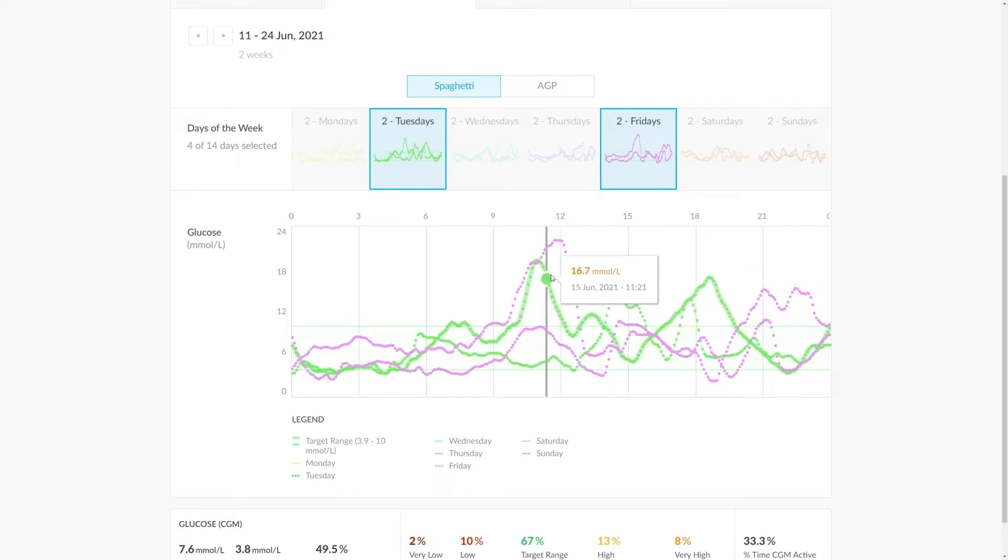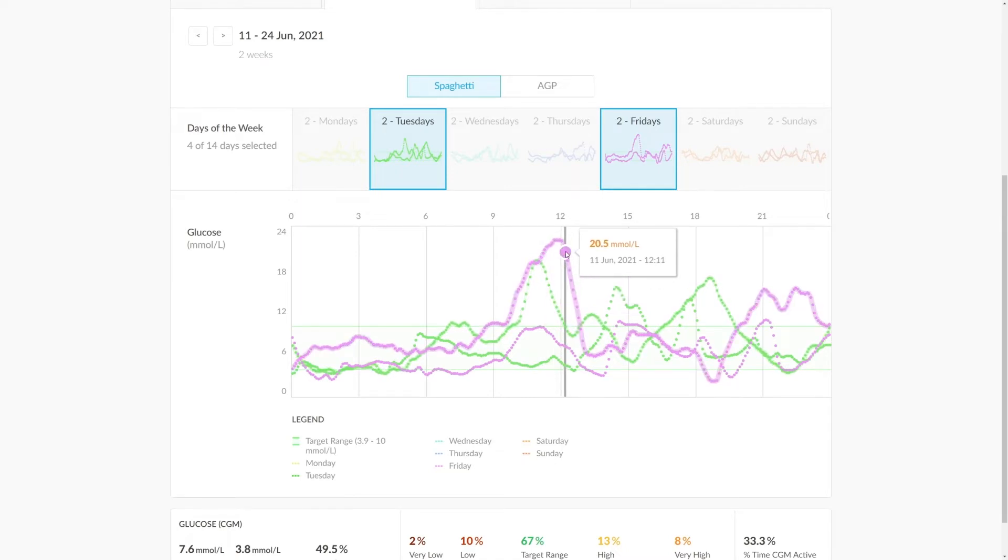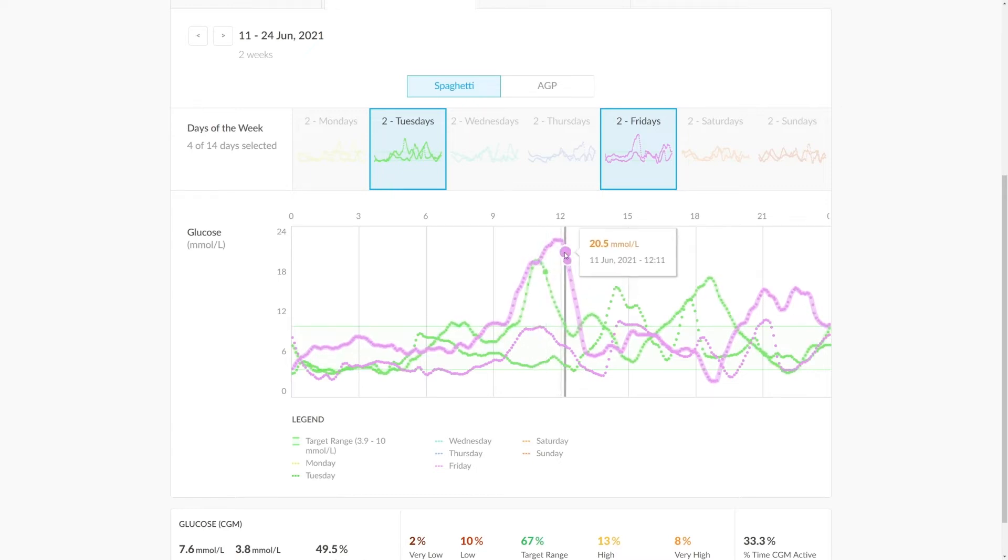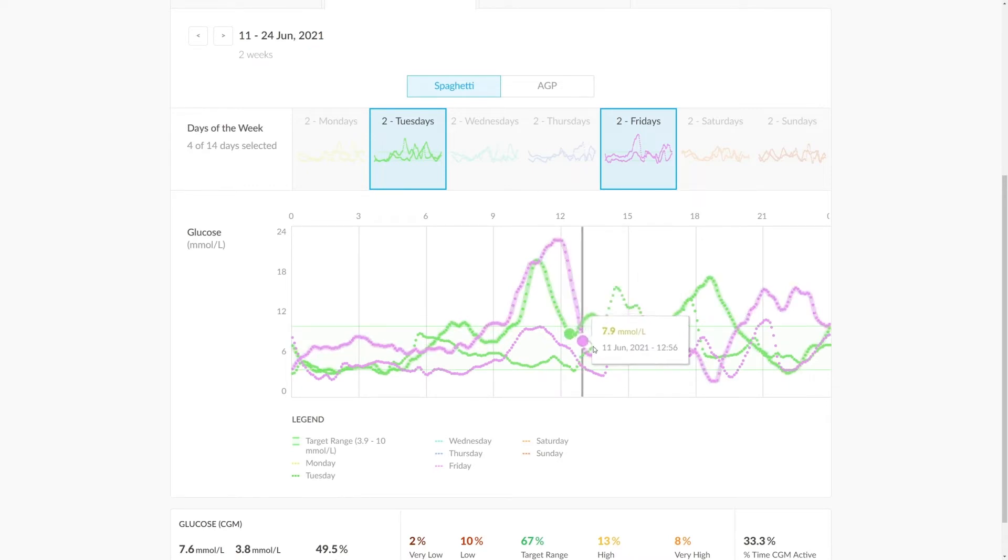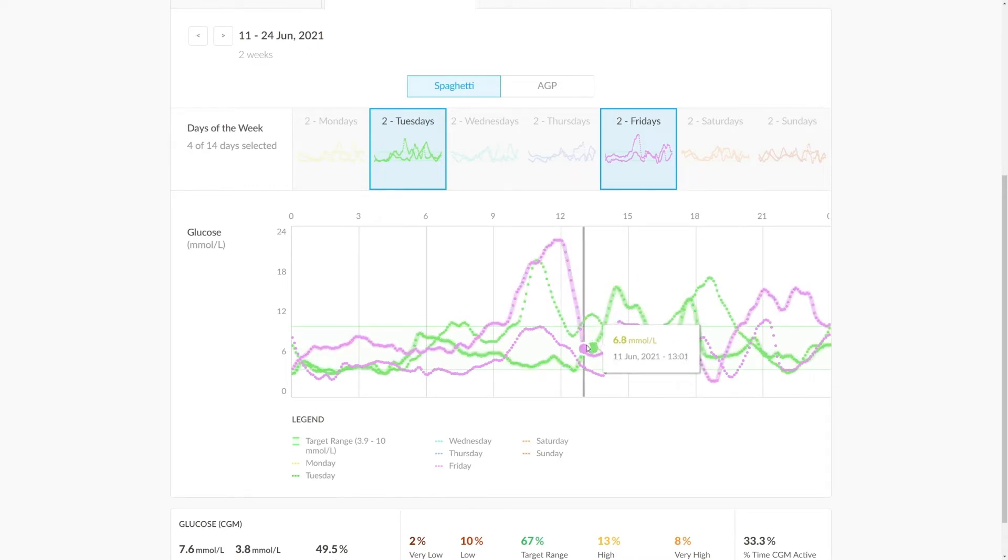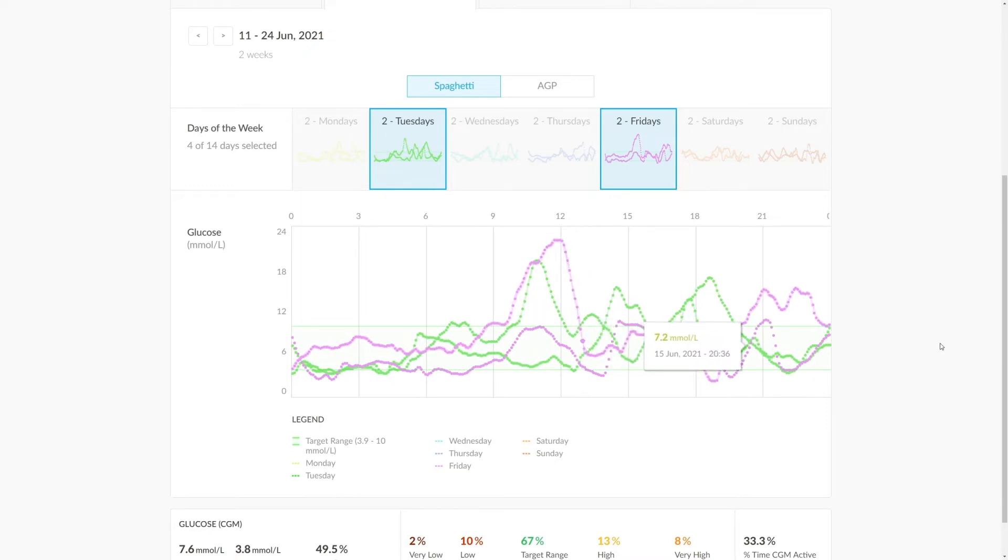And we can see that this peak here is actually on Tuesday the 15th of June, whereas this peak here represented in pink is on Friday the 11th of June. And for both of those peaks, the patient managed to bring the blood glucose down within the target range. This would be an example of good management that a healthcare professional would want to encourage and discuss with their patient.